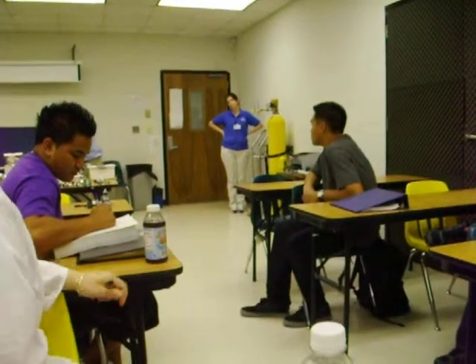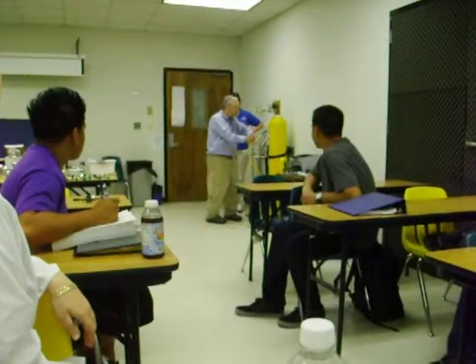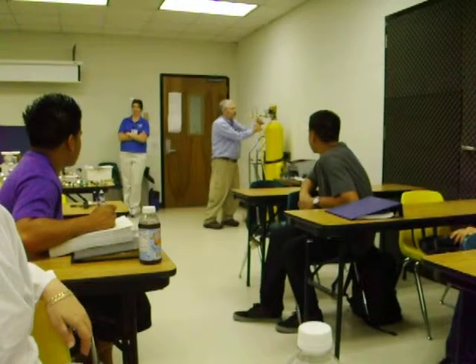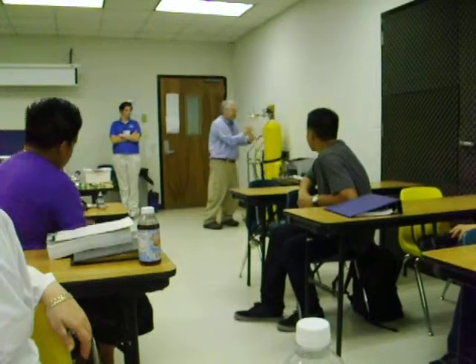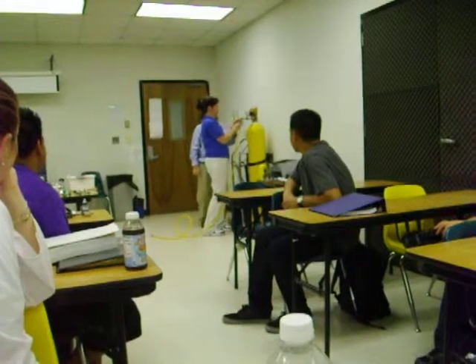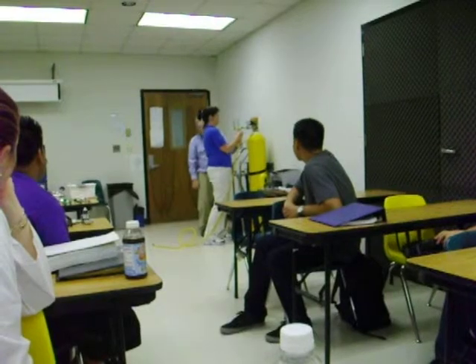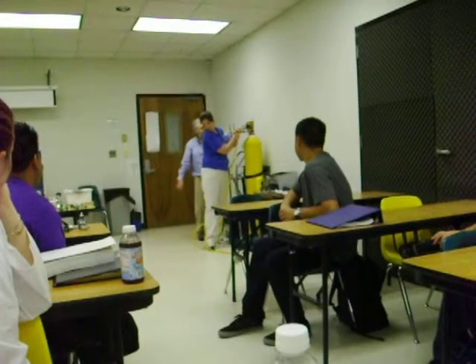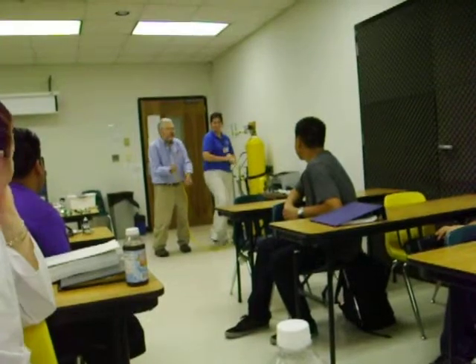Or, if we want to get really fancy, we can hook up another gizmo, and this is going to be for your education. This thing. Of course, now notice, what do you see here? These fittings? You've got a flow meter and a spare set of fittings. What's happening? Okay, we ran into a problem, didn't we?